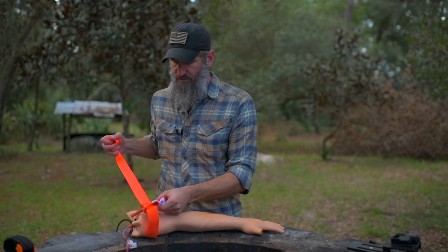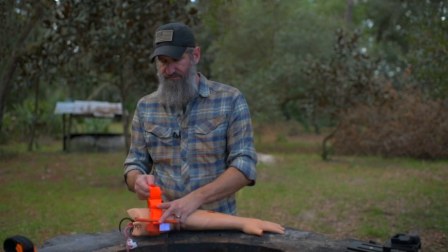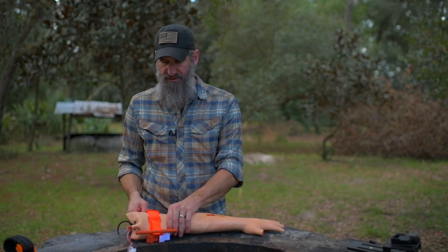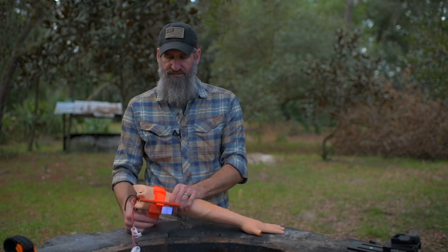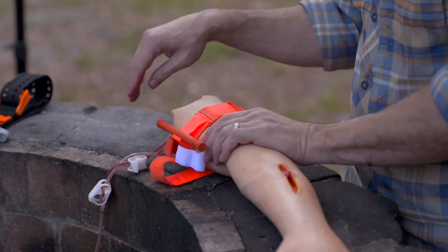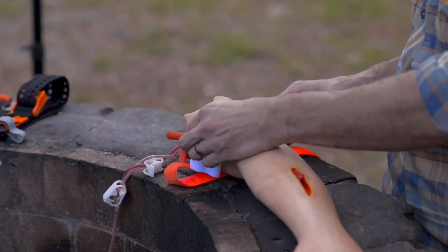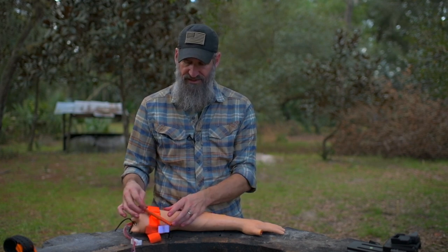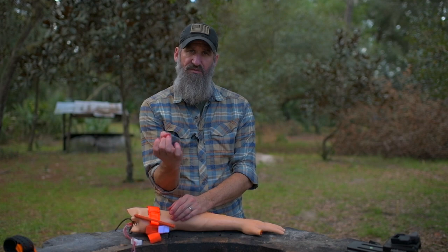Once the tourniquet is in place, get it as tight as possible before securing it. Take all the slack out before using the windlass, because you're trying to compress tissue and push the artery — or in some cases a vein — against the bone with that pressure.